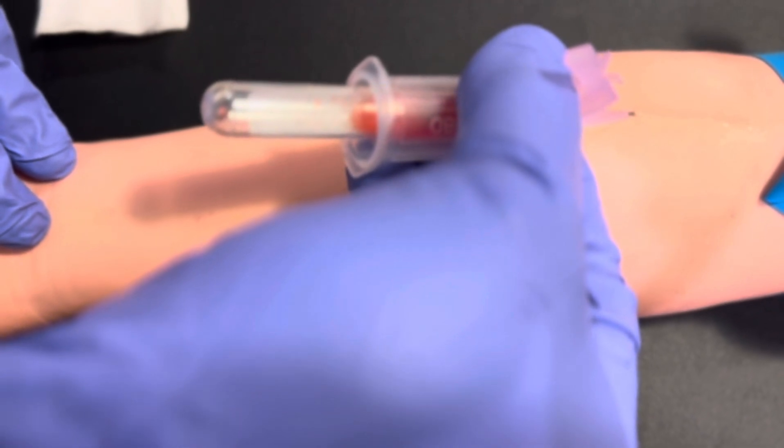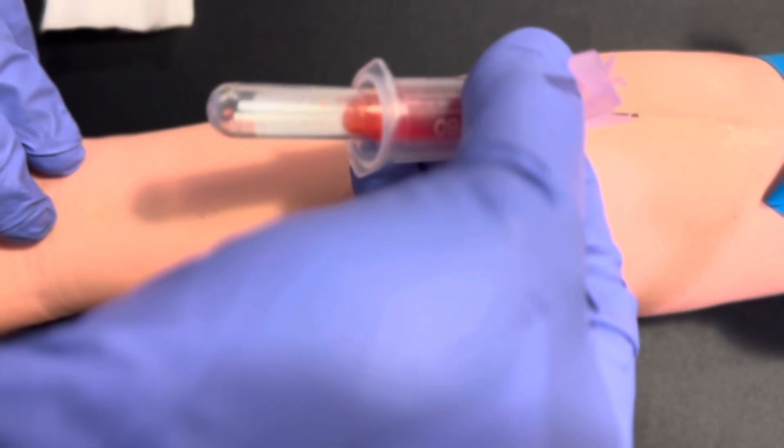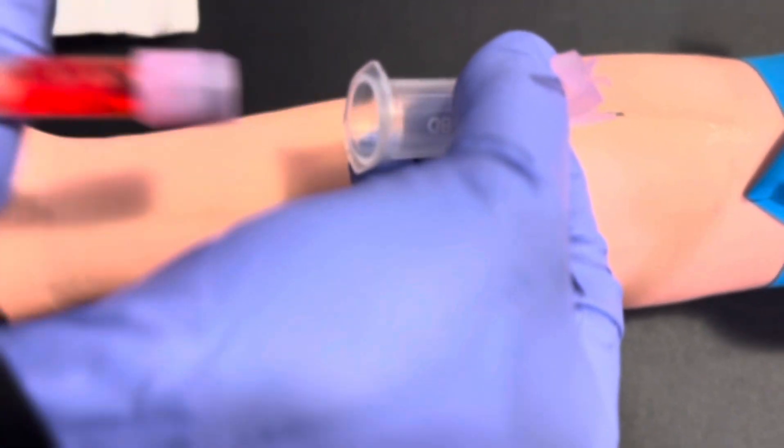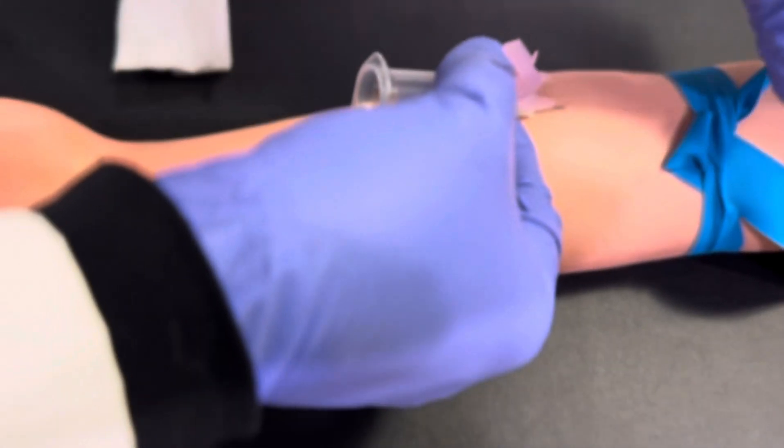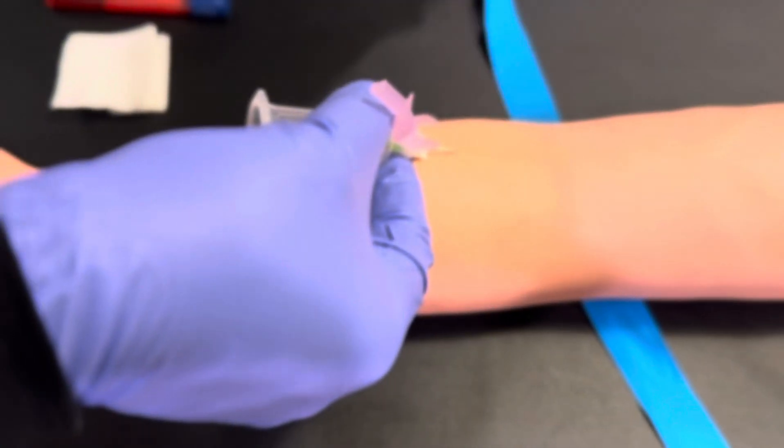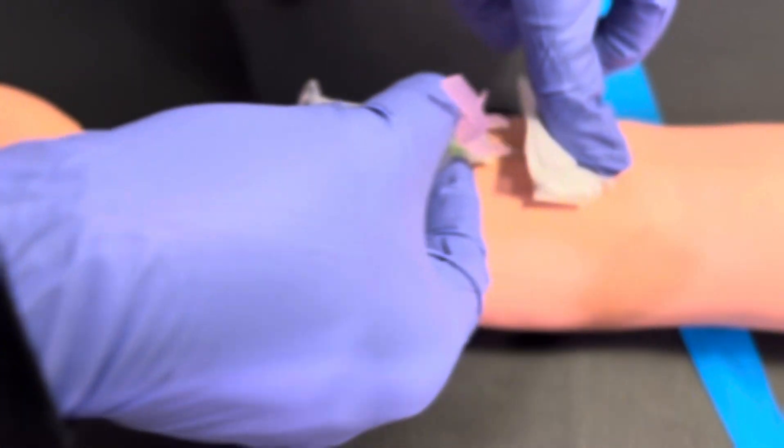Once the last tube is three-quarters of the way full, you can remove the tube, release the tourniquet, and apply your two-by-two gauze.